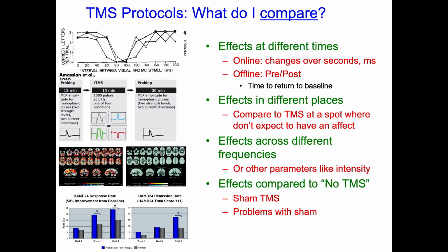Okay, and in fact, the idea in these protocols is, well, how do I see a TMS effect? So I can see it, for instance, online by looking at behavior. So looking at, in this case, people's accuracy.